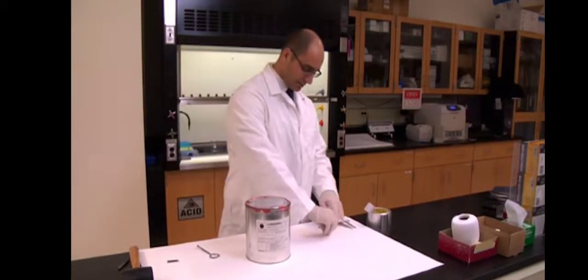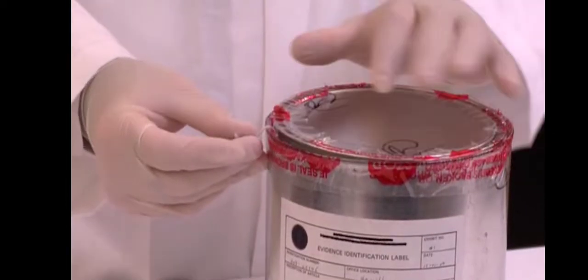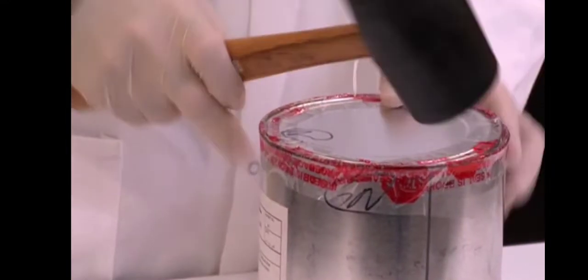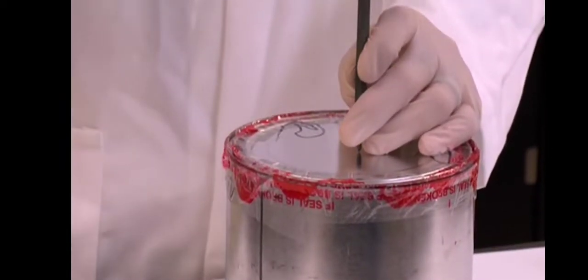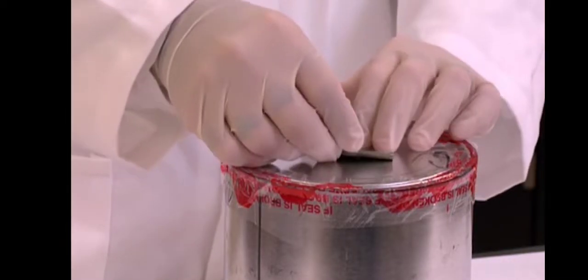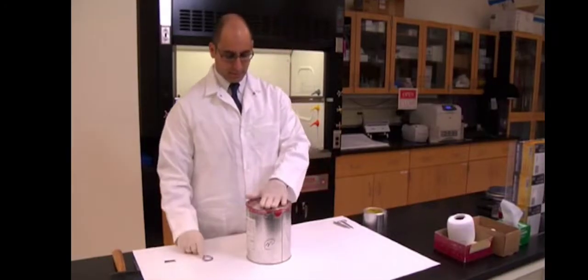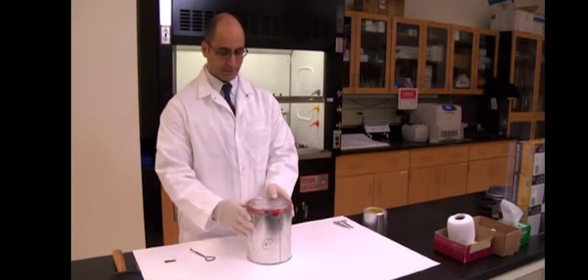We'd then take a carbon strip, put that strip in the can, and seal the can. I'll talk about the significance of that in a moment. I would also pop a hole in the top of the can and then place a piece of metal tape over that hole in order to seal the container. And the reason I'm doing this is for sample preparation purposes.